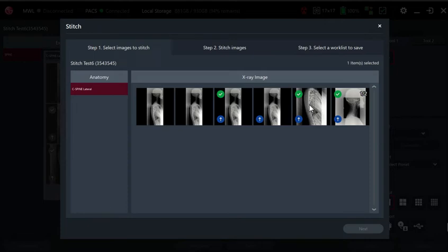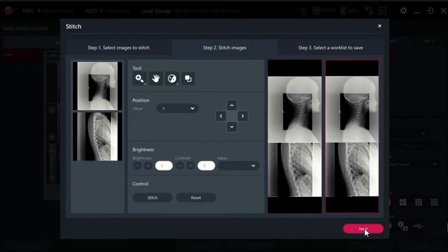We select the last two, and you select them in the order which you want them to be stitched together. Once you've selected them, you click the next button which brings you to step two.